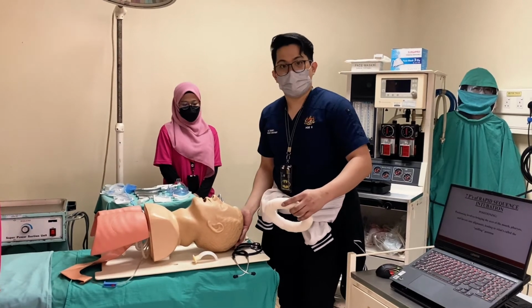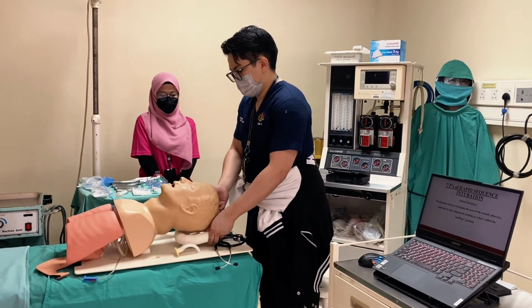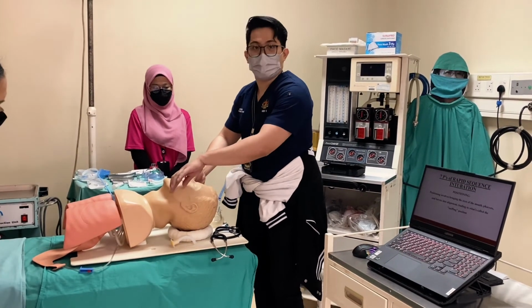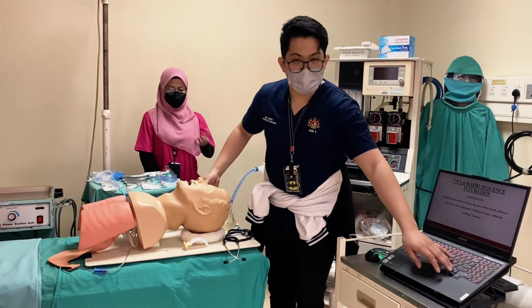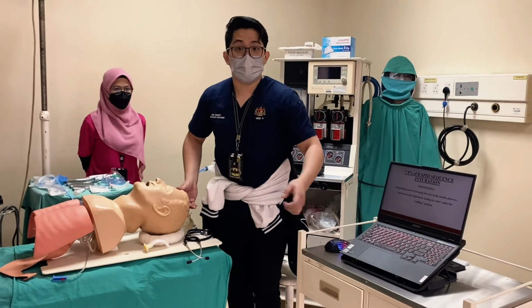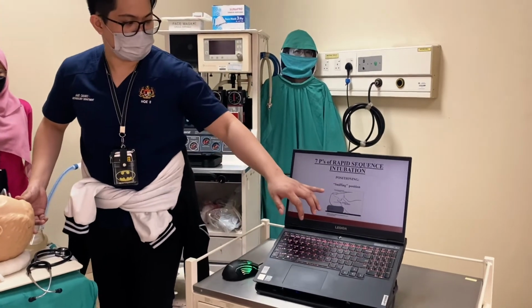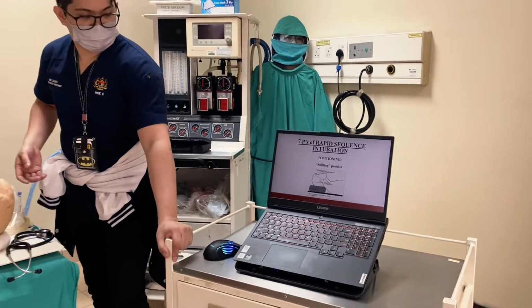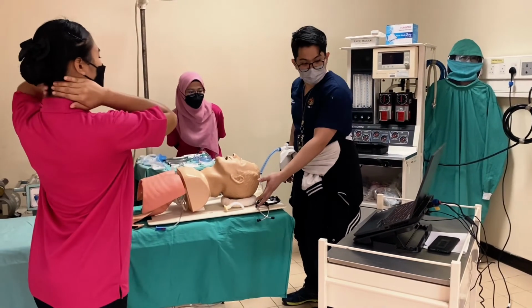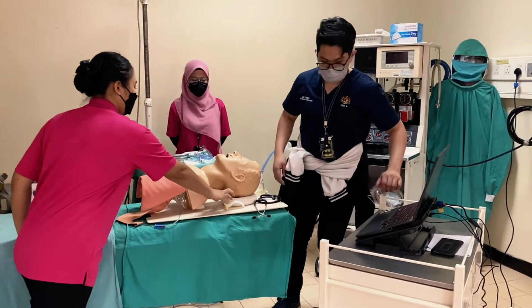To achieve the level of access between the mouth, pharynx, and larynx, we put one non-compressive pillow to elevate the head, which aligns the axes between them. It makes it easy for us to intubate the patient. That's the simplest way to explain it. This is the positioning we target for the patient. As you can see from my slide, the sniffing position is attained by putting a 10 centimeter non-compressive pillow. This is one example of a non-compressive pillow.